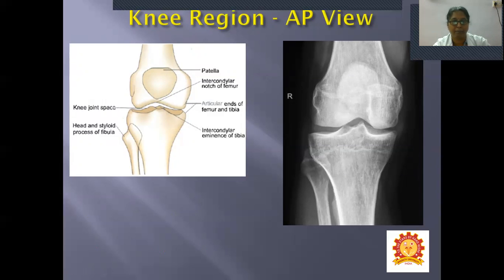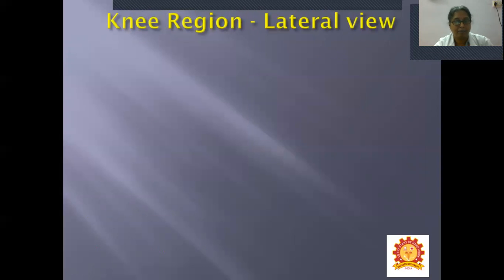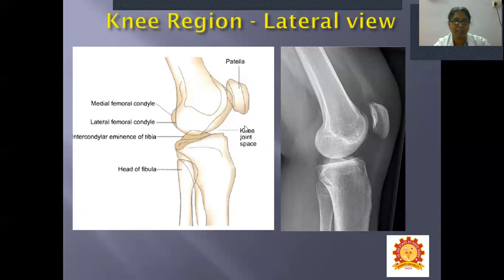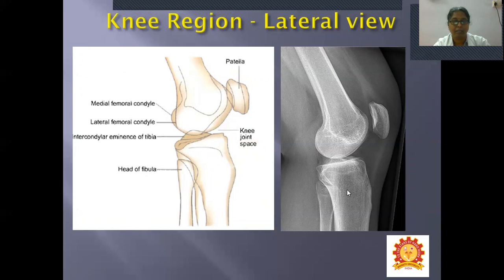In the lateral view of the knee joint, the patella is anterior, the joint space is visible, and the head of the fibula is seen again. The intercondylar eminence projects upwards. The lateral condyle and medial condyle of the femur are identifiable. Apply the schematic picture to the X-ray: patella anteriorly, lower end of femur with lateral and medial condyles, intercondylar eminence of the tibia, and head of the fibula.